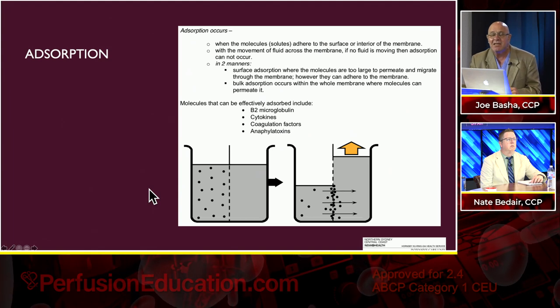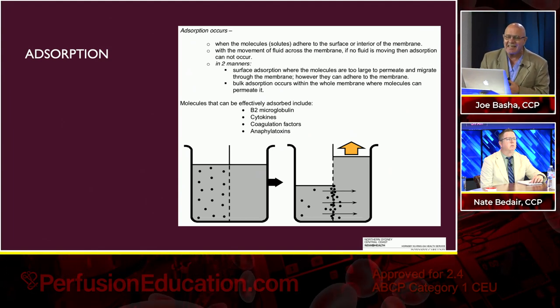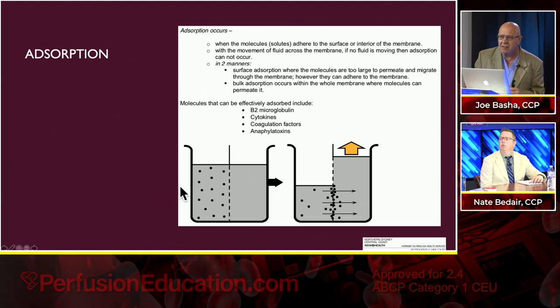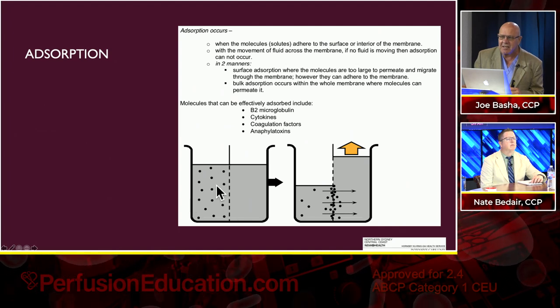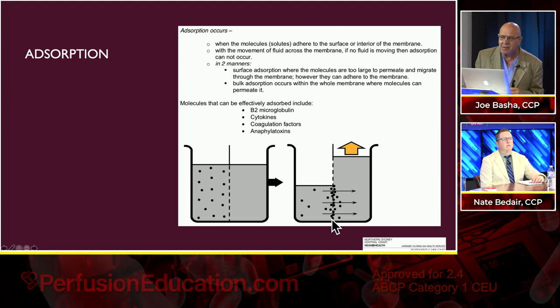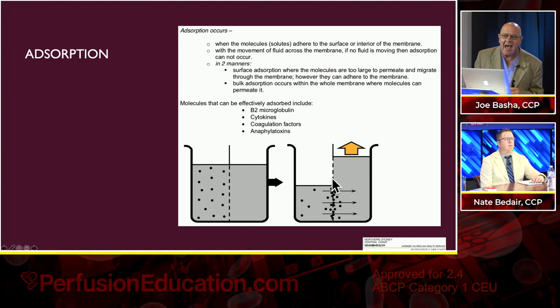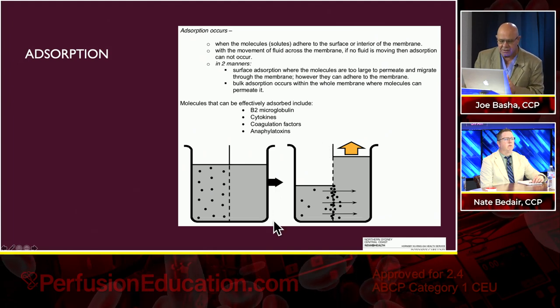We talked about adsorption, where molecules, because of a charge, will stick to the membrane itself. So if you look here, you see a semipermeable membrane. This stuff here is not coming across. You're putting hydrostatic force on it. You're getting some of it across, but look, most of it sticks. That is the concept of adsorption, where things stick to something.